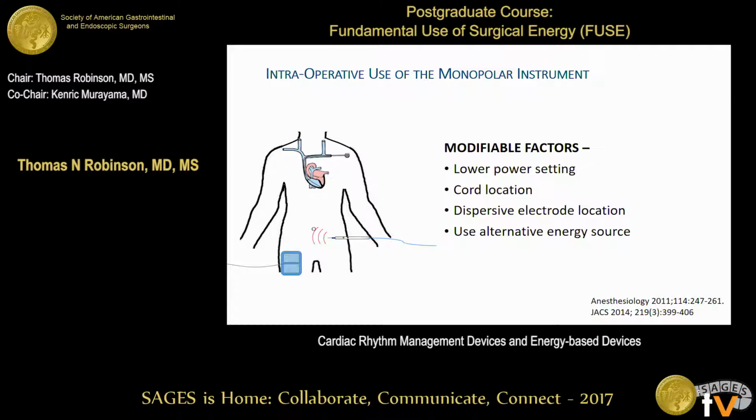And then the second comment is that Mark was really big on this: because healthcare is so fractured, somebody will get their cardiac implantable electronic device at their private cardiologist's office across town, and they will work with their cardiologist to get the right settings so that they feel good and have good ejection fractions. But those settings may not be known to that hospital system. So the thought is essentially that if you reprogram the device without the knowledge of whoever put it in or who's really tuning it up, you're going to change the settings, and the patients don't always follow up, and so you disrupt their normal cardiac settings where they're living optimally. Those are the two reasons, Pascal.